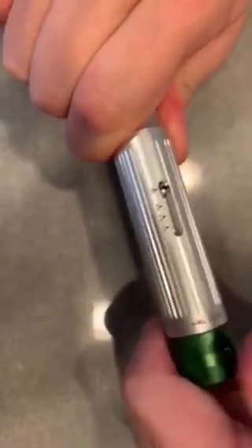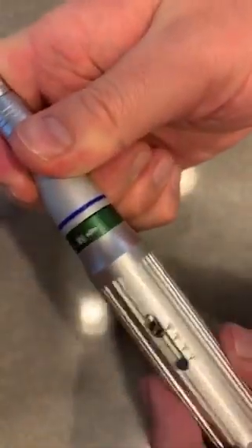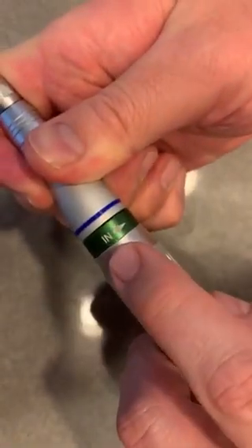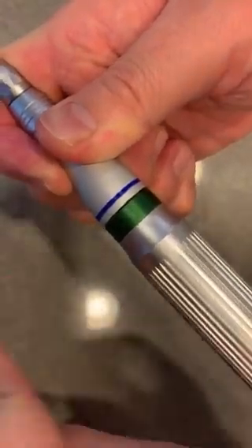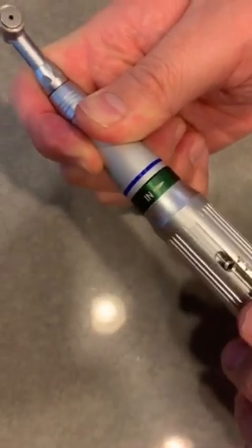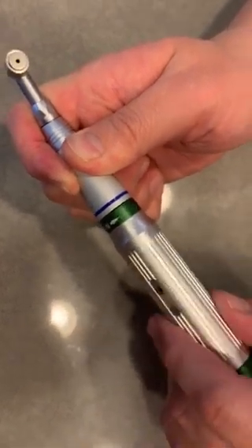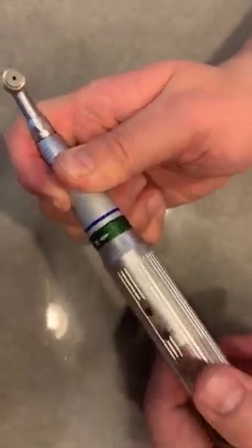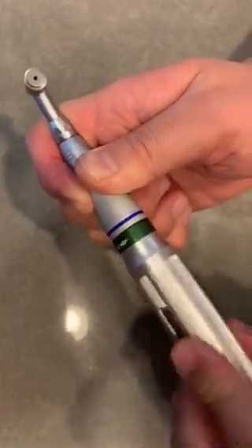Once you set the torque, connect the driver on the handpiece, then go to the side and you'll see the body with an indication arrow that tells you it's going clockwise to go in. If you want to go counter-clockwise and remove it, go the opposite direction to remove or reverse. To turn the screw clockwise, go in the direction of the whole body.